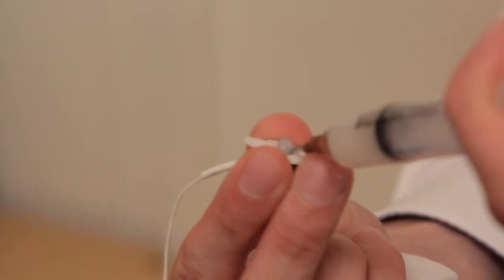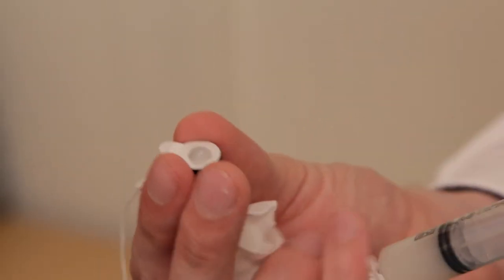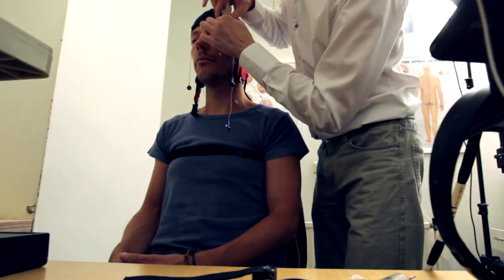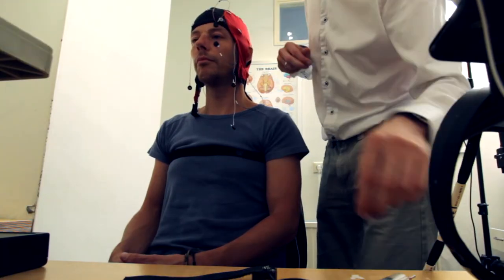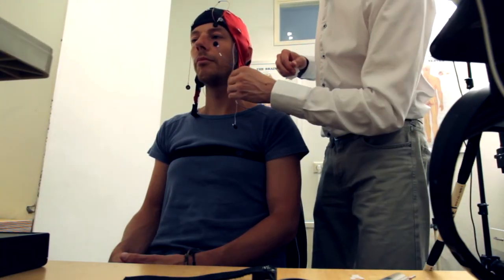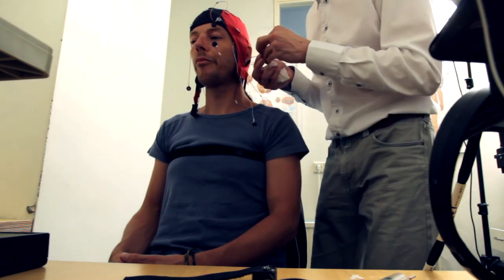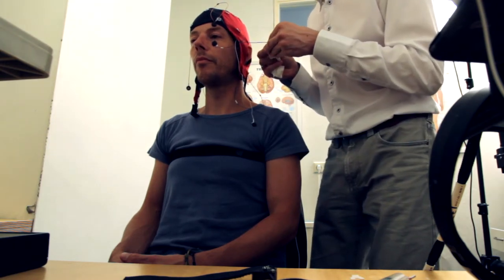The cap also contains a number of electrodes that are attached to several places on the face, such as around the eyes and the jaw. These electrodes measure eye movement and muscle tension.